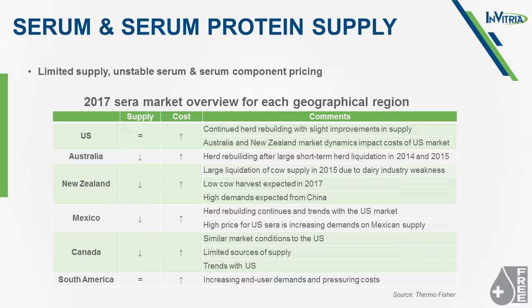In 1994, 30,000 liters of FBS were documented to be sourced from New Zealand. However, the country itself only reported 15,000 liters of annual production that year. A second major adulteration case in 2013 was documented with the dilution of FBS with bovine albumin, water, and other growth-promoting substances by a major global supplier. Subsequent investigations by the FDA concluded that approximately 280,000 liters of FBS were affected between 2008 and 2013.